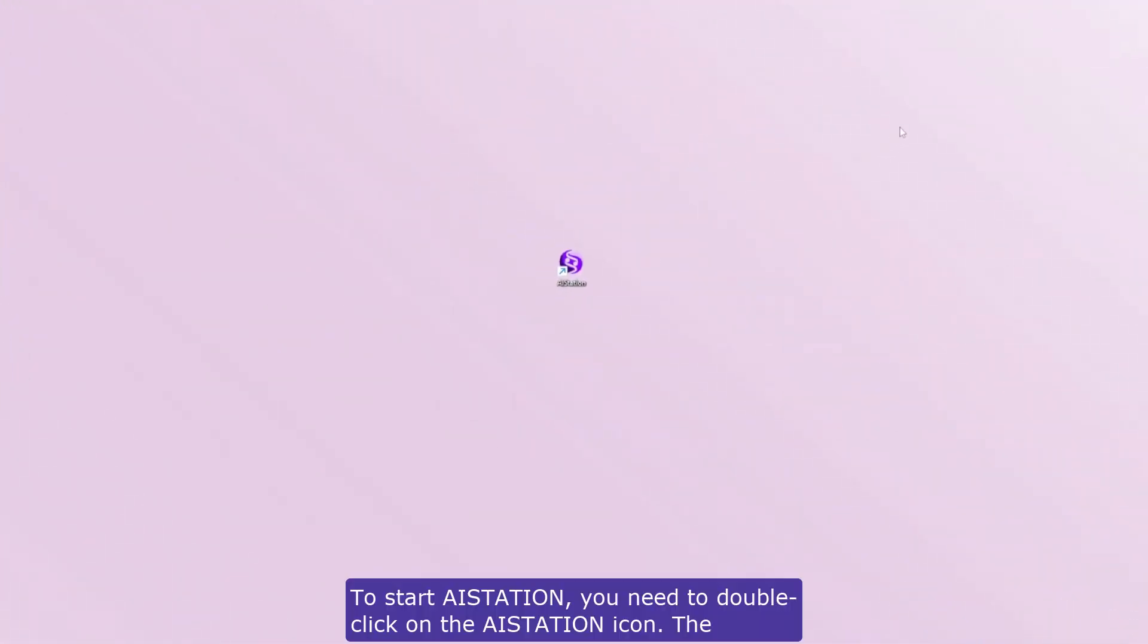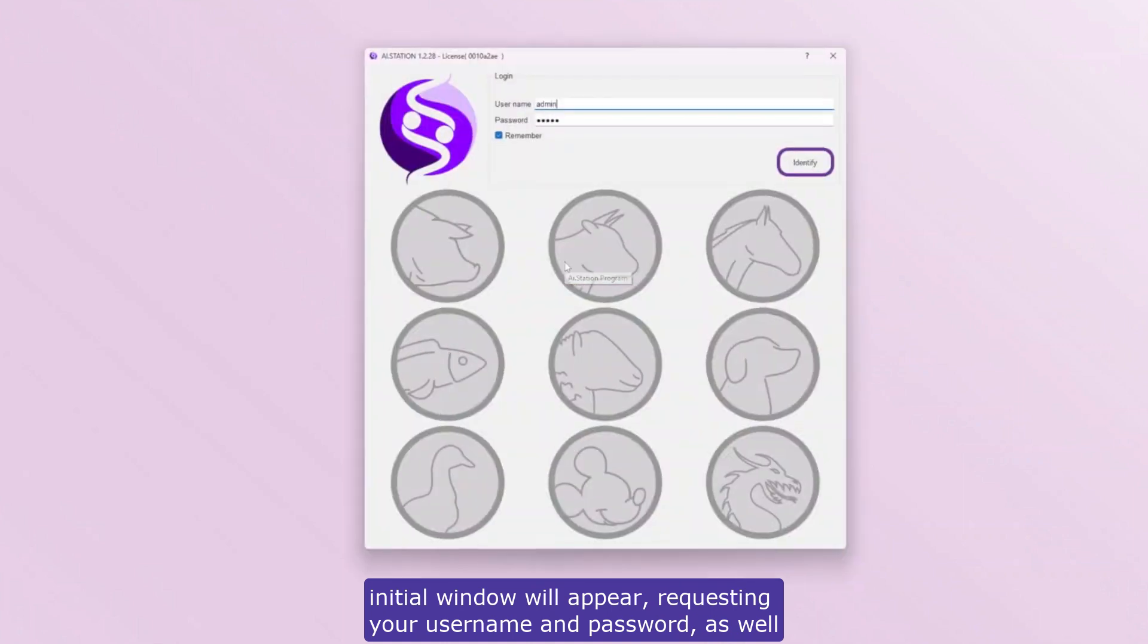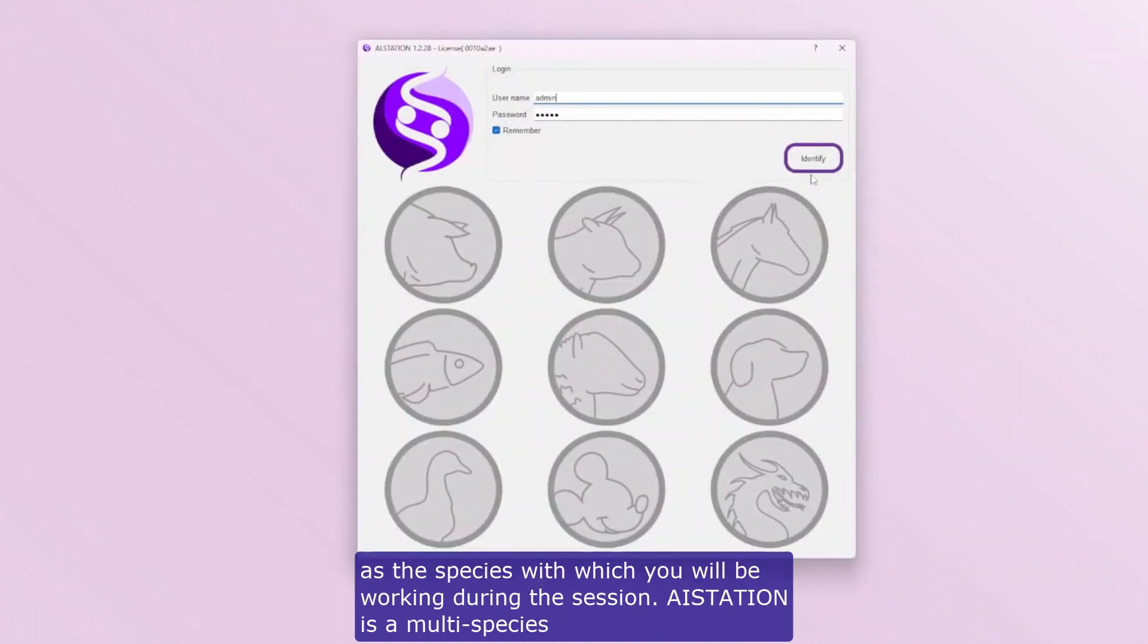To start AStation, you need to double-click on the AStation icon. The initial window will appear, requesting your username and password, as well as the species with which you will be working during the session.